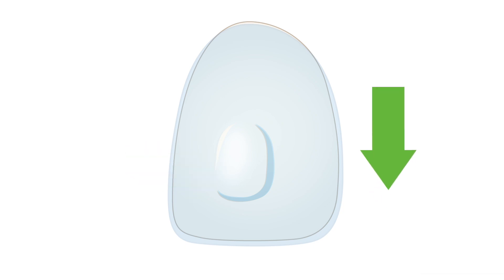Engagers, also known as attachments or buttons, are temporary composite resin bumps that are bonded to the teeth. The aligners grip the engagers like handles to gain leverage and achieve difficult tooth movements like rotations and extrusions.